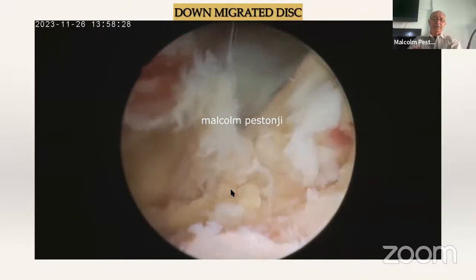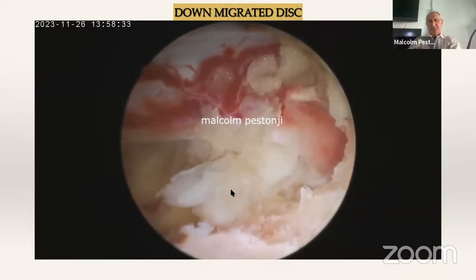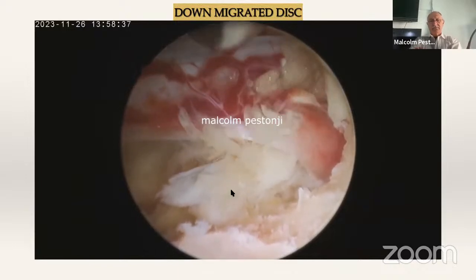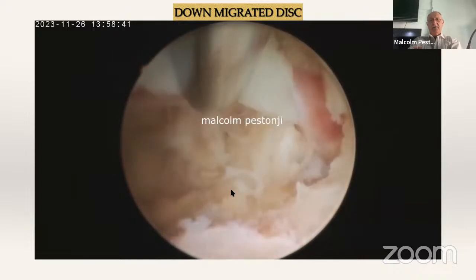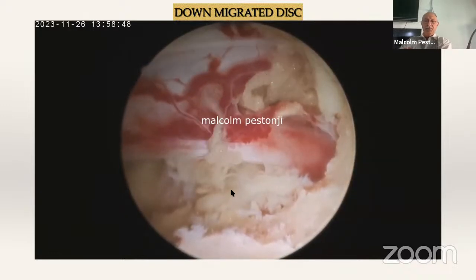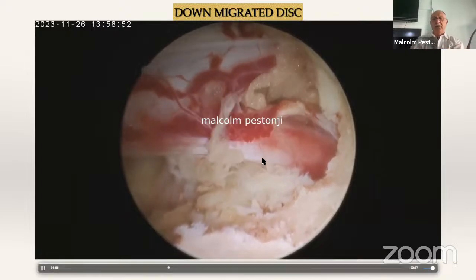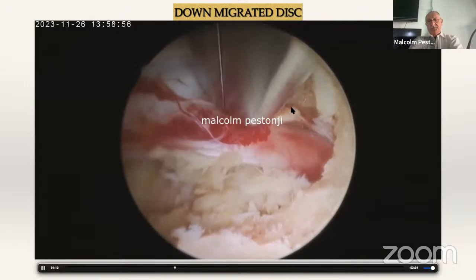Slowly pull it, keeping in mind that there is no movement or pull on the dural edge. This way, I do not need a root retractor. I do not need the services of an assistant. And I can do this job very comfortably. I prefer to go from the shoulder of the root rather than the axilla in such cases. And you can see how nicely the axilla has got decompressed when I remove the disc from the shoulder.